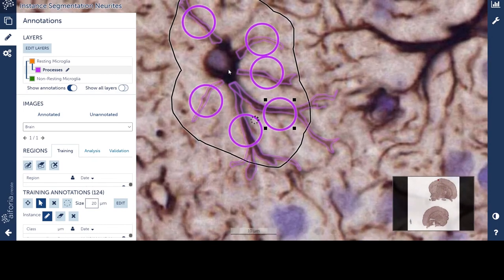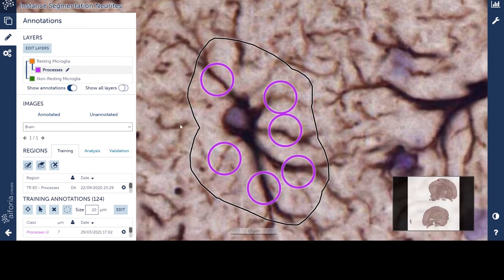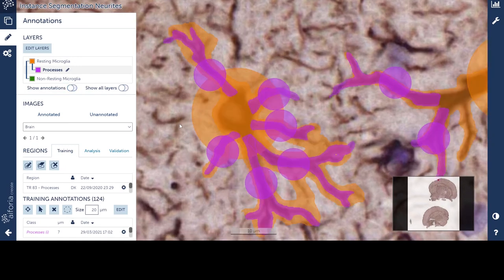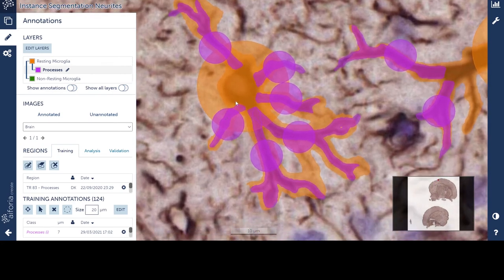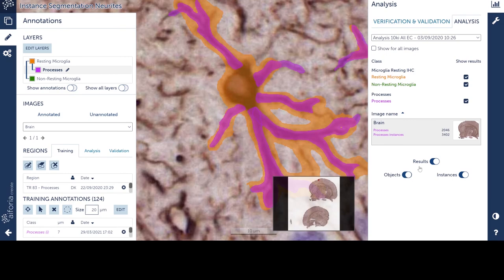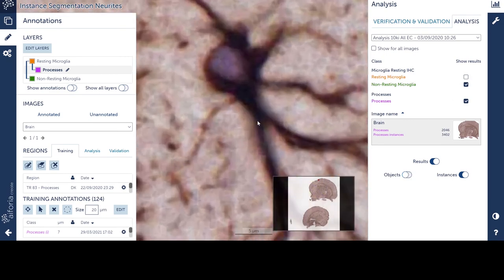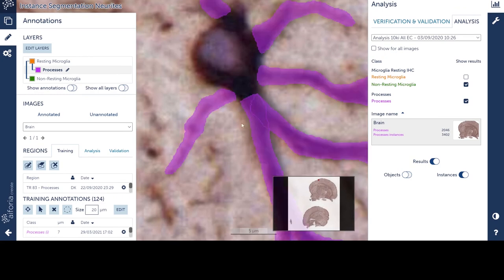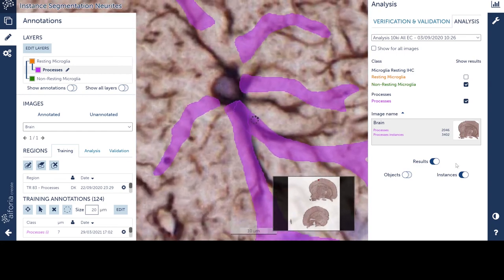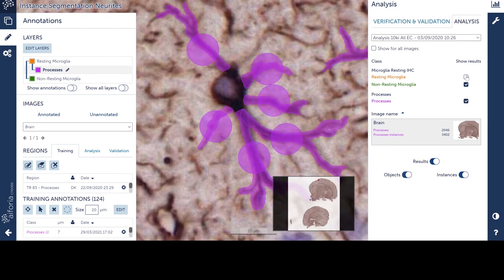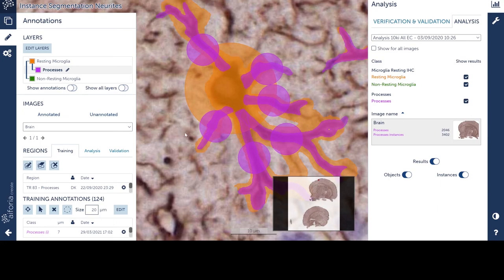Even though they originate from the same stem, here are the instances — we have to mark them in advance. And here is the result of the analysis: the cell in orange and the processes, each of them separately in purple, with their corresponding instances. The circles are instances, and here we have the segmentation. Both of those processes are segmented separately, even though they originate from the same stem. So if this is something of interest — which it is in this project — then instance segmentation is the method to choose.